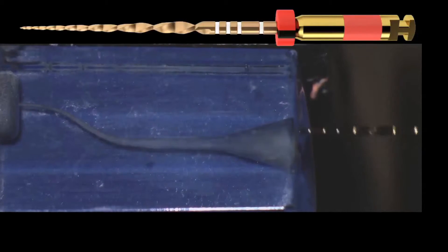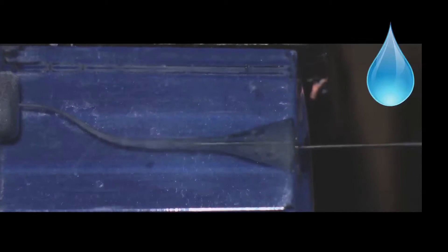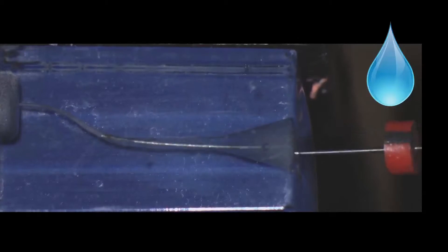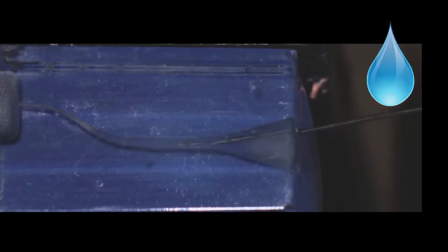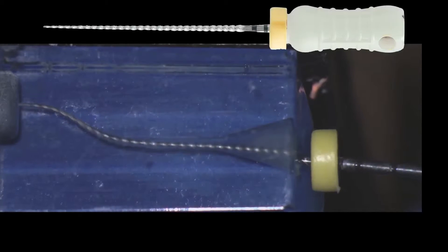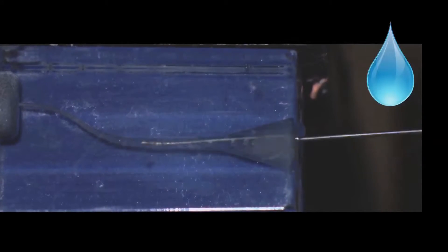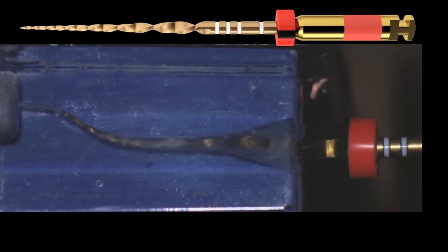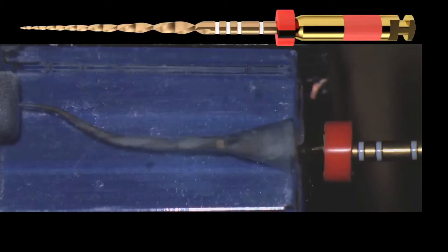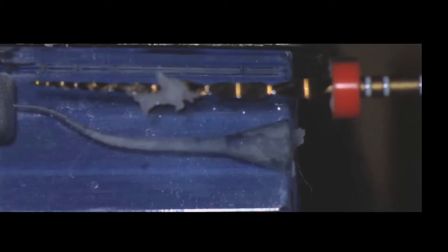You can see clearly how effective and efficient this instrument is. The irrigation needle will now penetrate deeper and deeper into the canal — just the space that has been created by WaveOne Gold. We remove the irrigation needle, recapitulate, and make sure we have not blocked ourselves, using the file that established working length. Irrigate again. Then we go a second time with WaveOne Gold, another three to four millimeters amplitude strokes. You can see the efficiency of this instrument, how it cuts dentinal walls.